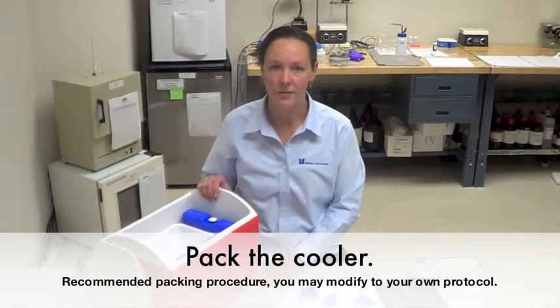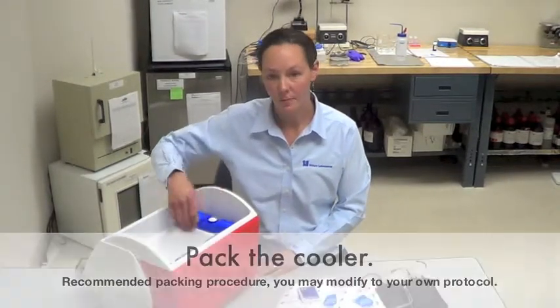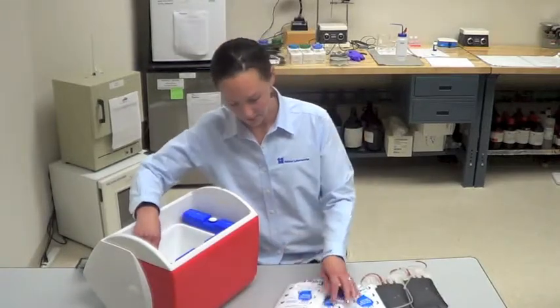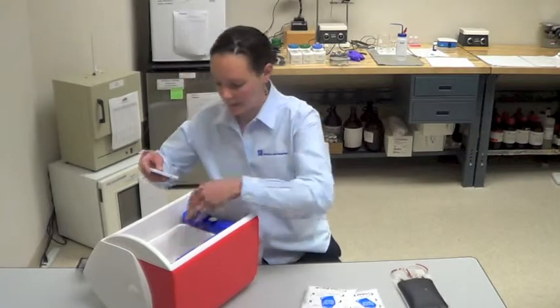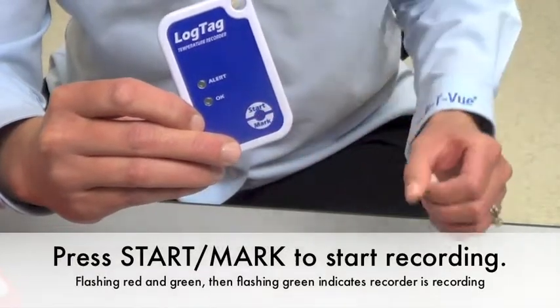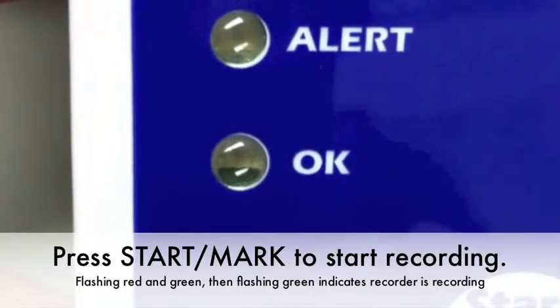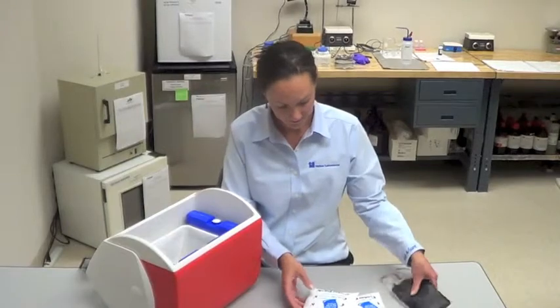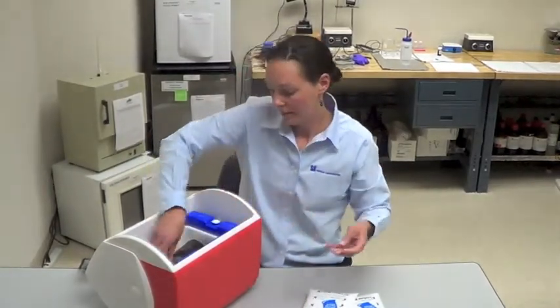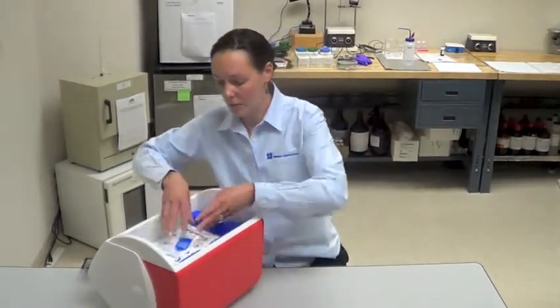Now, to pack your cooler for this validation procedure using two units of blood, we'll line the cooler with the freezer packs, place a cold pack in the bottom, place one of the units of simulated blood, press the start mark on the temperature recorder — you'll see the green okay button flashing to indicate that it is recording. Place that on top of that unit of blood, put another unit on top, and then top it off with two cold packs.